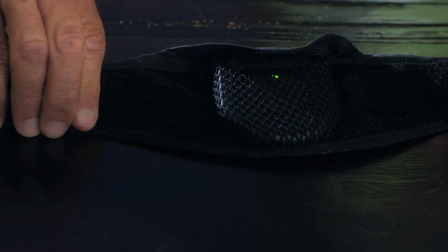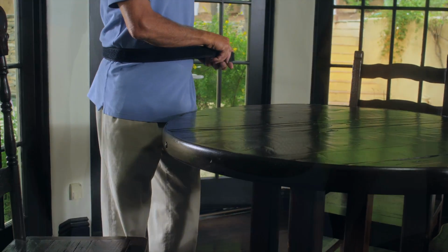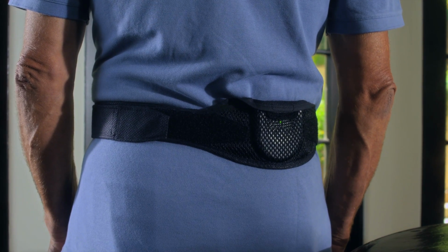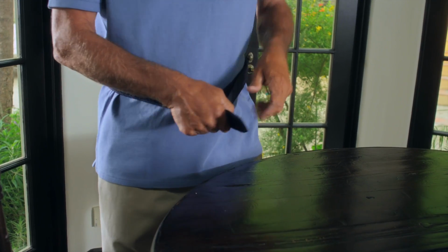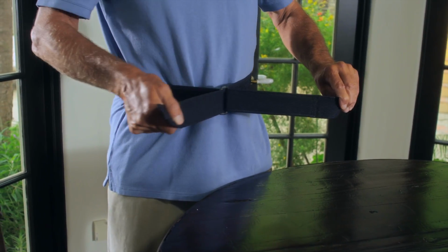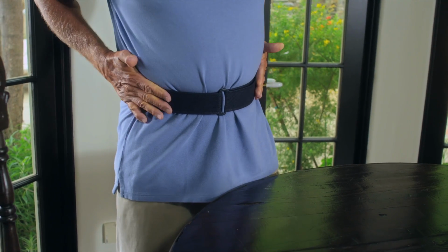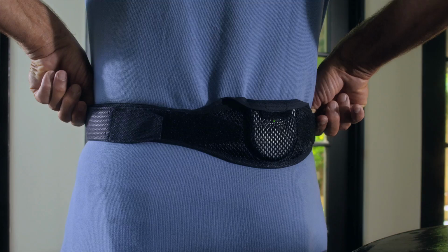Then close the pouch and place the charger belt around your body, making sure that the power button and mesh fabric are facing out. Adjust the straps so that the belt is slightly loose at first. To properly use the charger belt, both straps must go through the belt loop. Position the charger over the stimulator.